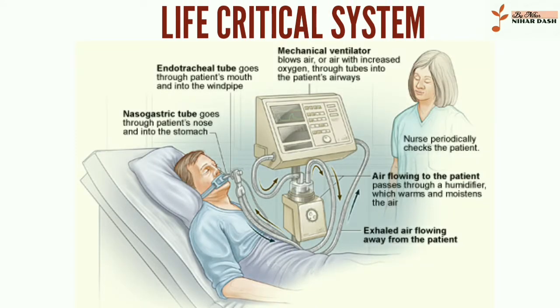Life-critical system: because failure may result in death, mechanical ventilation systems are classified as life-critical systems, and precautions must be taken to ensure that they are highly reliable, including their power supply. Ventilatory failure is the inability to sustain a sufficient rate of CO2 elimination to maintain a stable pH without mechanical assistance, muscle fatigue, or intolerable dyspnea. Mechanical ventilators are therefore carefully designed so that no single point of failure can endanger the patient.